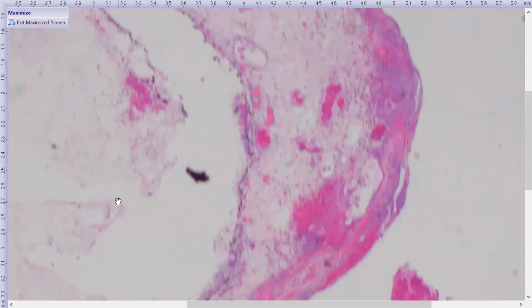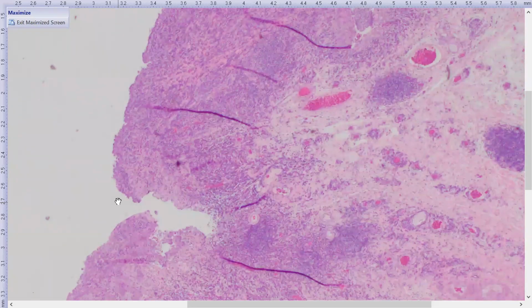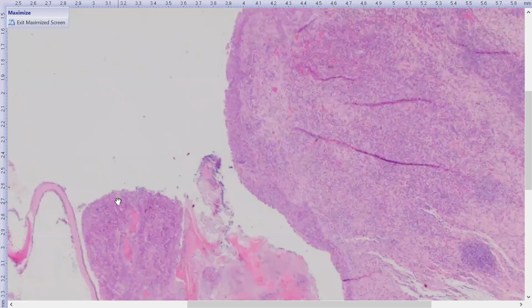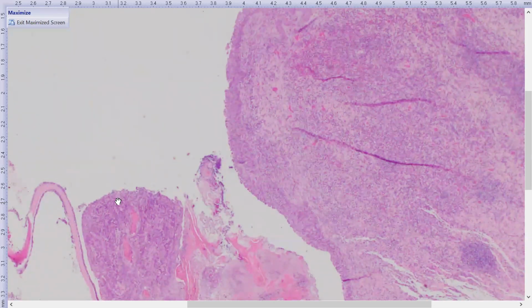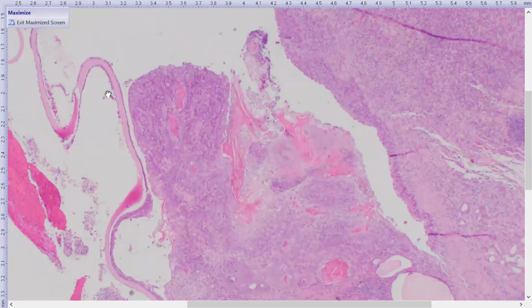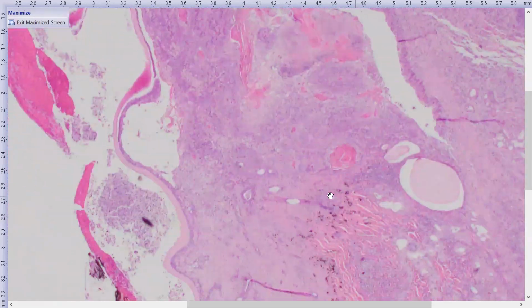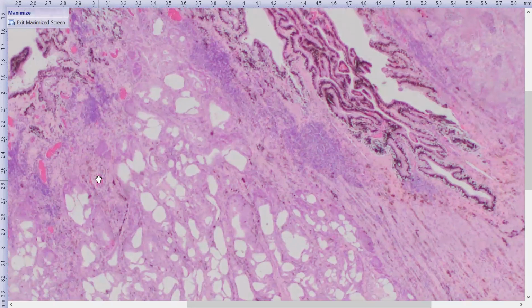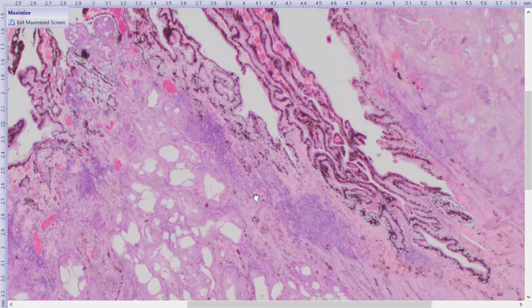But the more interesting thing that I would like to point out is to go back to where we saw that purple stuff at the edges. So a lot of this is inflammation, but as we look on some of the edges of the tissue in particular, so we're at one of the edges where the cornea was absent, basically at the edge of the corneal rupture. And there are these cells that are tracking around the end and kind of going into the globe from there. And then as we walk back here, we have this Descemet's membrane, which is basically detached. There's no recognizable stroma associated with it. And then just solid abnormal cells at this edge here, distorting the peripheral cornea, what's left of it, and the sclera at the limbus. You can kind of maybe guess that the limbus is here based on the distribution of melanocytes. And extending into the ciliary body over here, it's very distorted, but we can see ciliary body plicae and then these abnormal cells in the ciliary body stroma.